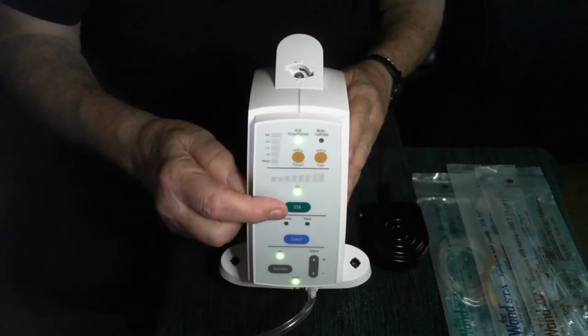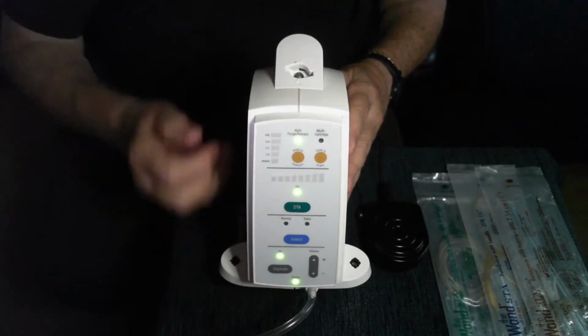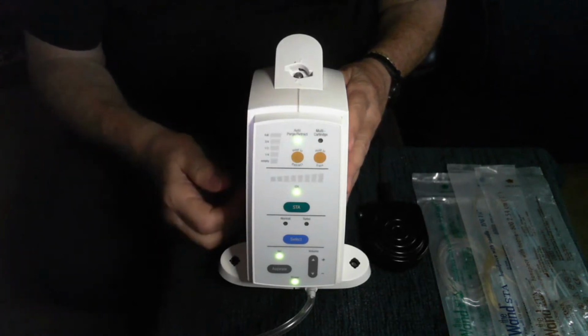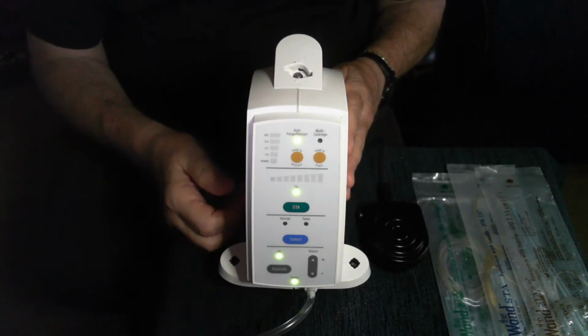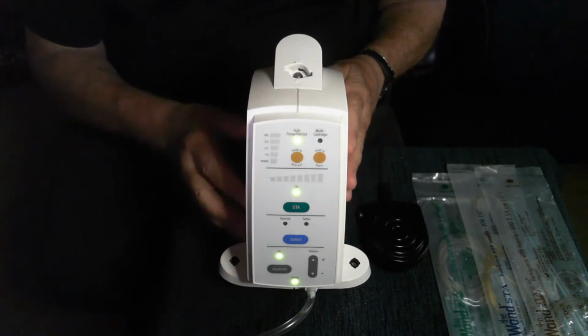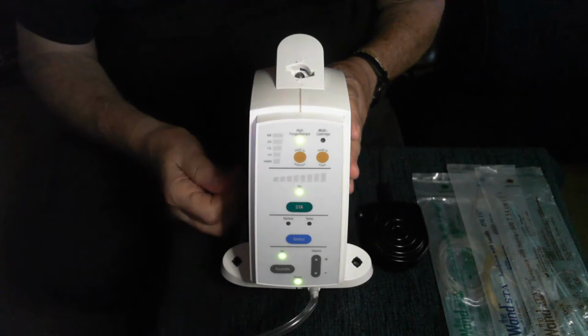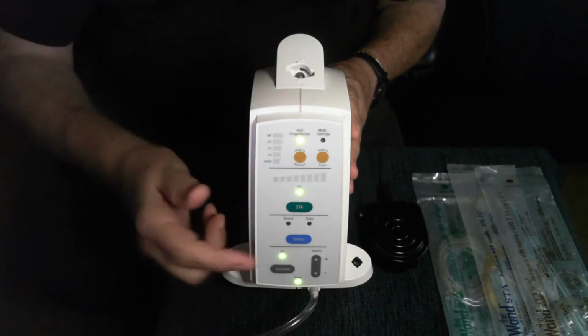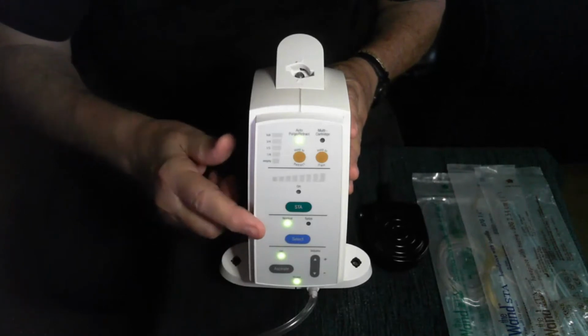So we notice also that this shows us that we're in the STA mode, and it defaults to that. Now, the STA mode will just produce a flow of anesthetic, which we call the control flow, which is 1 drop every 2 seconds. So you don't have to stay on that flow rate. If you're going to do an infiltration or a mandibular block, you can go to a faster flow rate. And we do that by hitting the select button and going into what's called the normal flow rate.